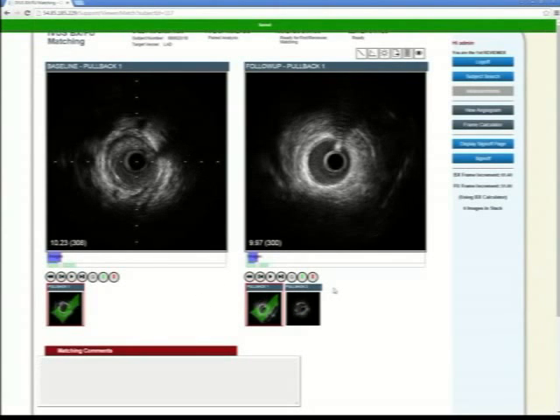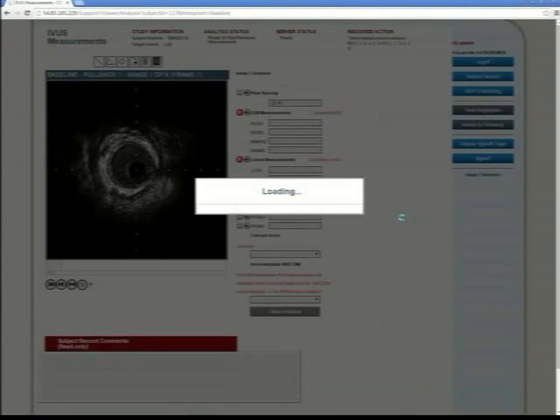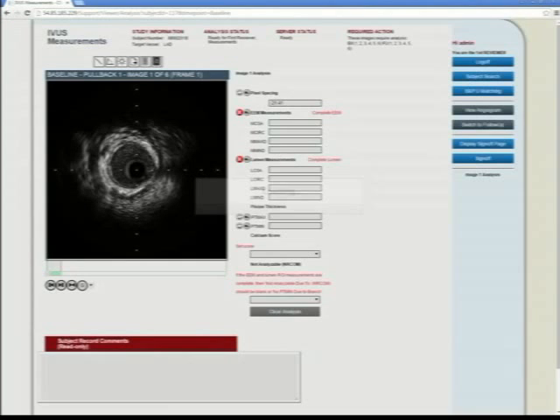Right. And so now save that, and it goes automatically to the baseline pullback for analysis. What that has done now, in just that quick process: we don't analyze every video frame in these cases because we'd be analyzing thousands of frames. Right, these are big. These are huge files. So our methodology is defined to analyze 1 millimeter segments throughout the pullback. And that provides us the power we need to do our analysis.